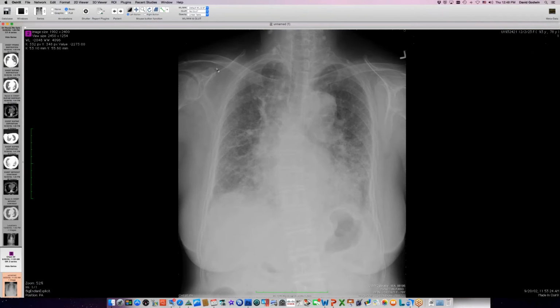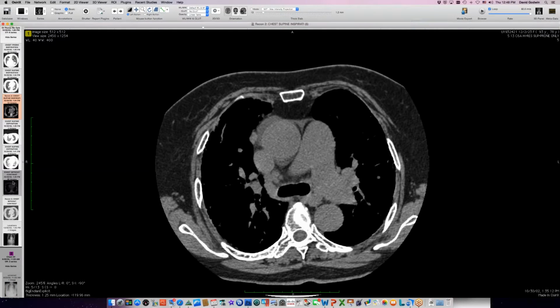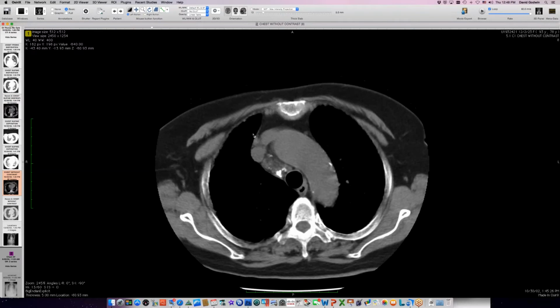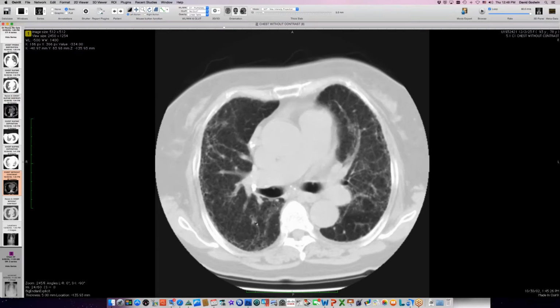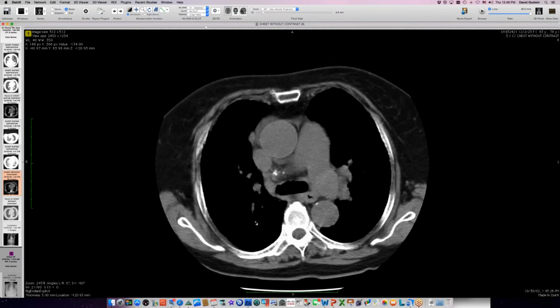Merry Christmas. So here's an elderly Chinese woman in her 70s at the time of this radiograph, who has a history of childhood tuberculosis when she was 5 years old, and her father died of fulminant tuberculosis, so she was exposed at that point. What struck me about this case was the number of calcified lymph nodes in the neck. And I'm trying to get an older chest radiograph scan that goes even higher up and shows that these calcifications went way up. So this is indeed tuberculosis, and she's got mediastinal lymph node calcifications and lung calcified granulomas as well. She also has some peripheral fibrosis. She's a cigarette smoker. She died of pulmonary fibrosis and old age.